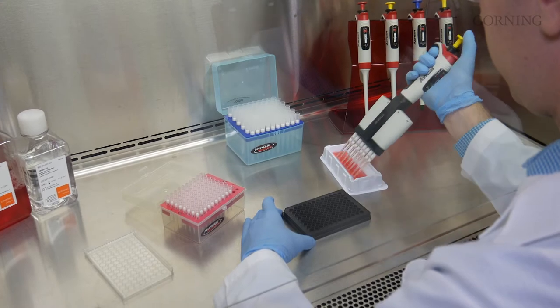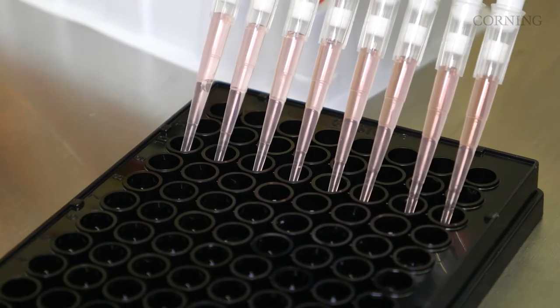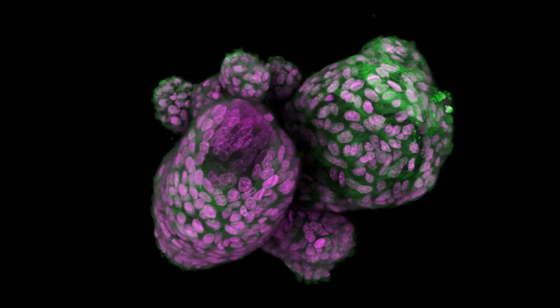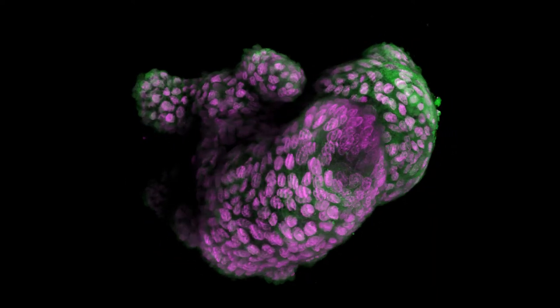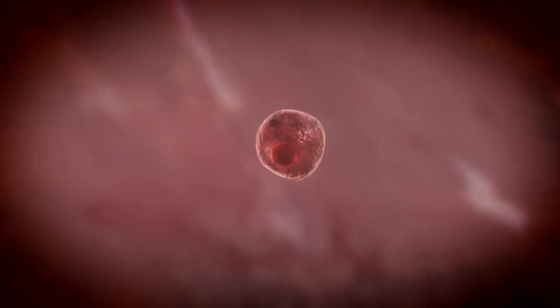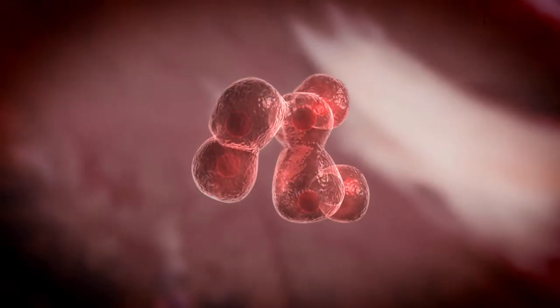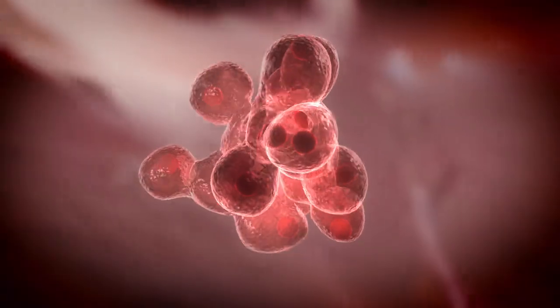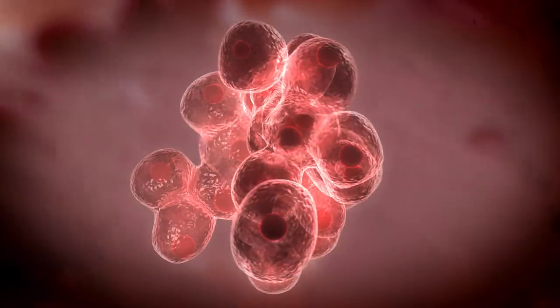3D cell culture models have become more and more relevant across many areas of research. Bioprinting fabricates a 3D tissue-like construct layer by layer using cells, spheroids, or organoids suspended in a bioink. It makes it possible to reproduce structural features seen in vivo and explore the cell-to-cell relationships that affect tissue functionality.